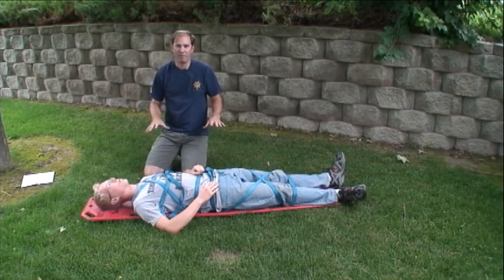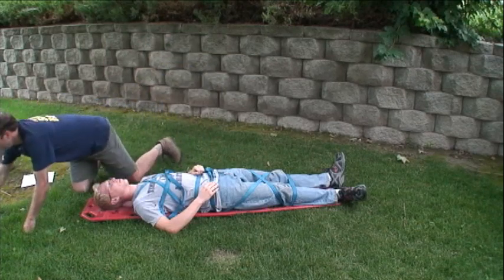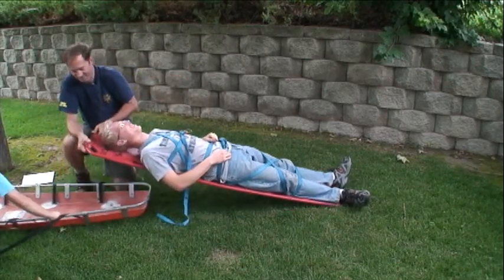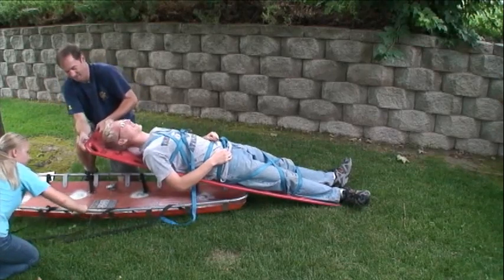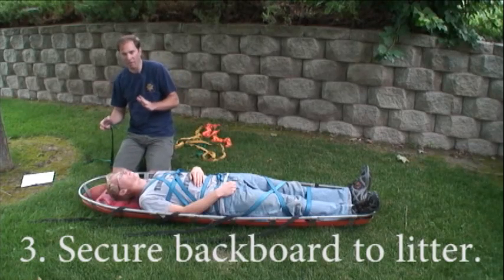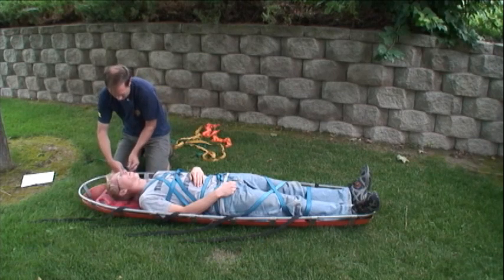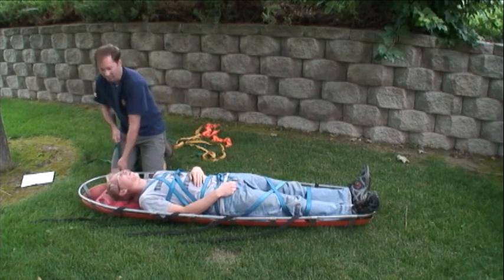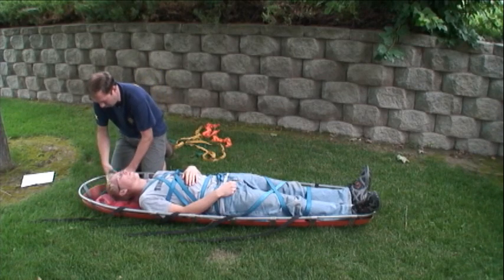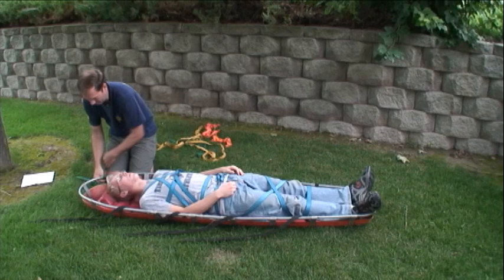With the patient securely fastened to the backboard, the next step is to secure the board to the litter. Just tie a round turn and an overhand onto the rail — that snugs itself up really nicely. Then do a clove hitch on the backboard, and finish with another round turn and overhand.